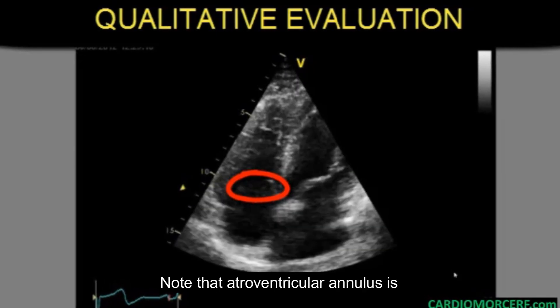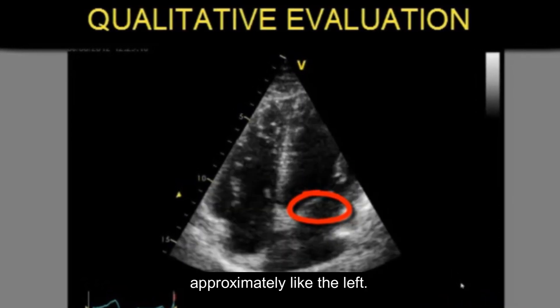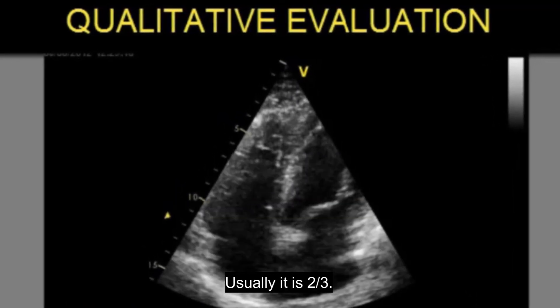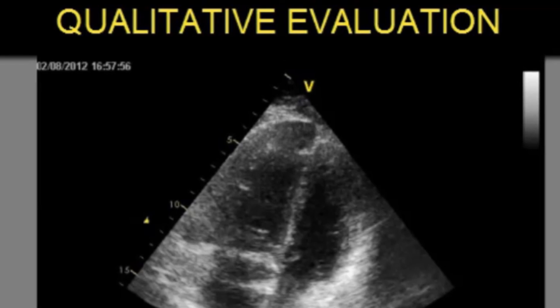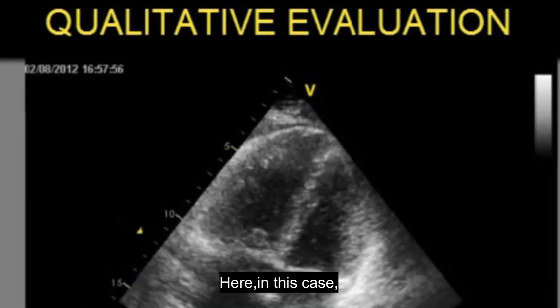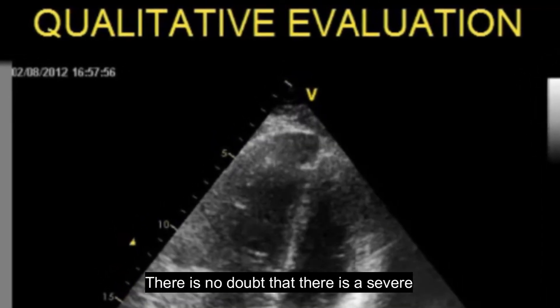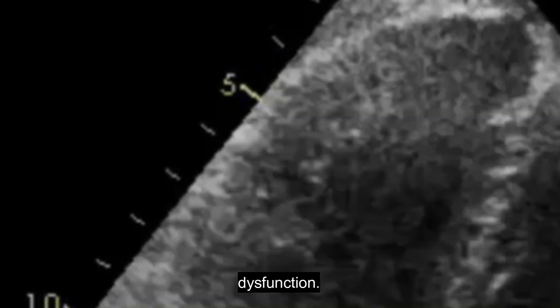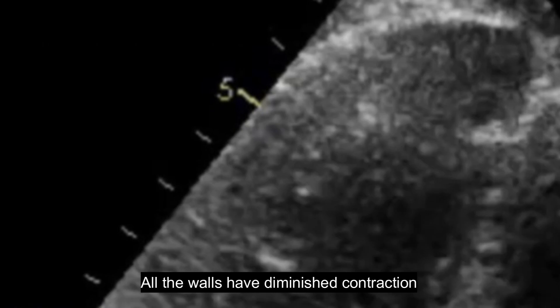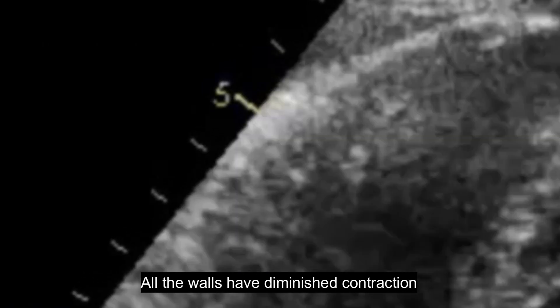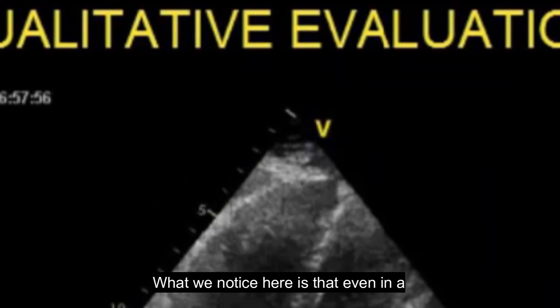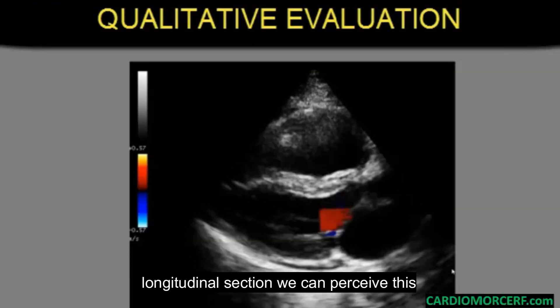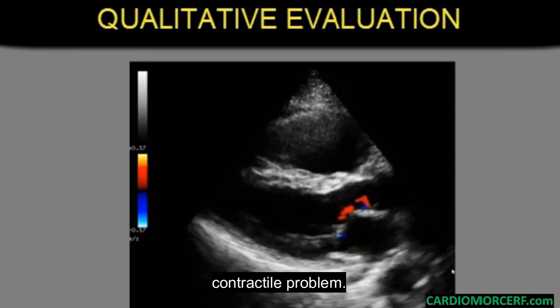Note that the atrioventricular annulus is approximately like the left; usually it is two-thirds of the left. Here, in this case, there is no doubt that there is severe, significant right ventricular systolic dysfunction — all walls have diminished contraction. What we notice is that even in a longitudinal section, we can perceive this contractile problem.